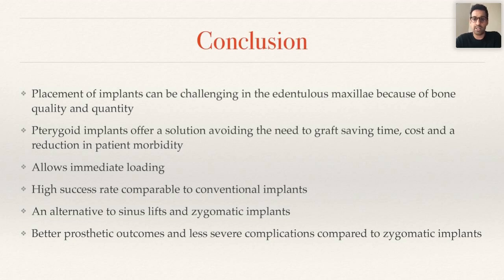You can potentially immediately load with pterygoid implants. We've got literature that supports success rates equivalent to conventional implants. It's an alternative to sinus lifts and zygomas, and certainly we have better prosthetic outcomes and less severe complications compared to zygomas. Okay, that's me done, guys.